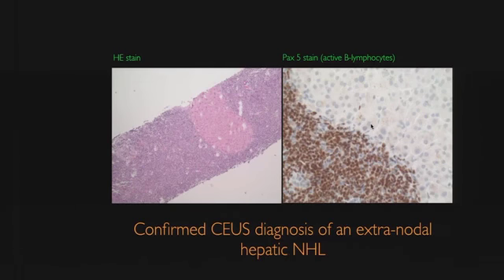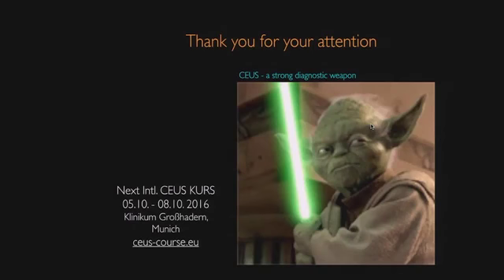So thank you very much for your attention. So you see, CEUS is a strong diagnostic weapon.